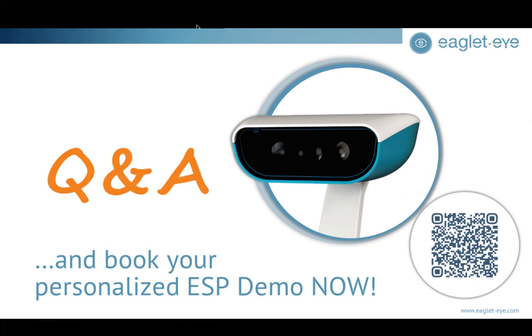And it seems like a lot of the new lenses that are coming out, especially freeform lenses, are all based on height data. Correct. Okay. And it's not unique to the ESP. All topographers use elevation data as well. It just depends on what kind of screen you're looking at. For example, one thing that some practitioners will look twice at initially is that curvature power map, which is what we're talking about with other devices. We don't look at the data in that same way, but we can understand how the data works. It's just a little bit of a different way of looking at it.